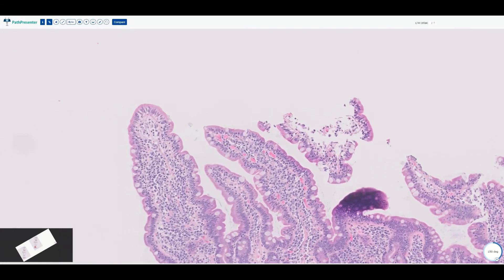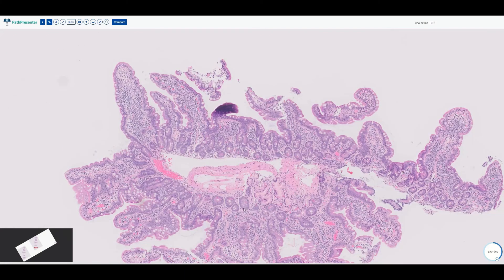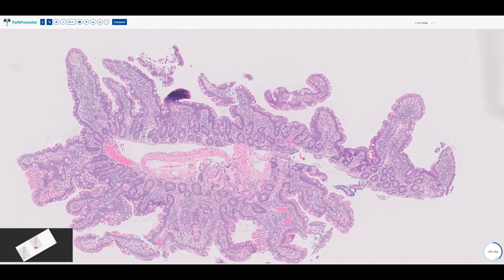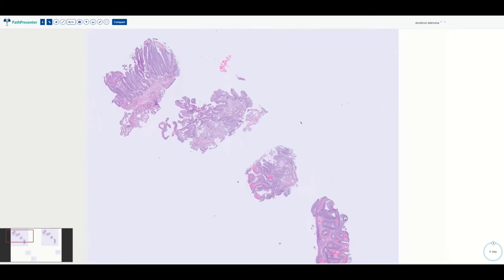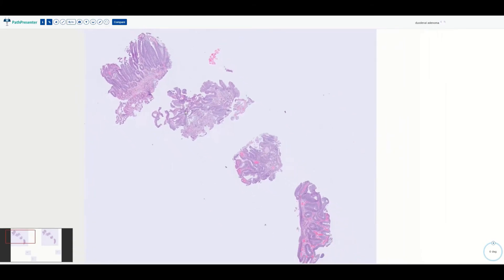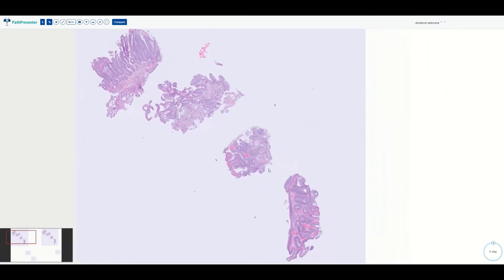No pathologist is going to sit there and formally count — they'll just look at that and say, that's too many. With experience comes faster processing speed. That is celiac disease. Now for our third and last entity in this video — let's look on low power.